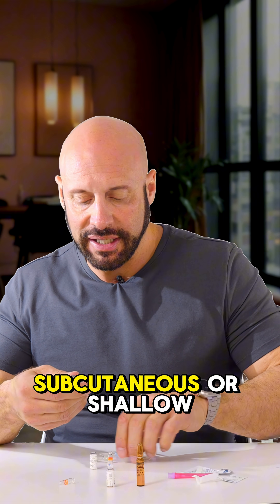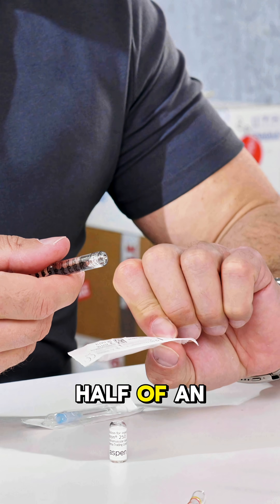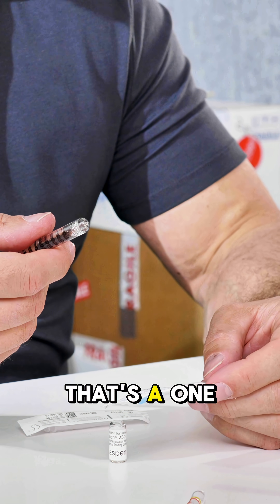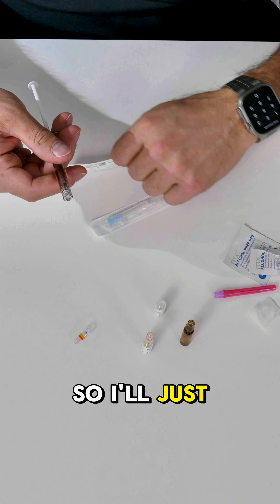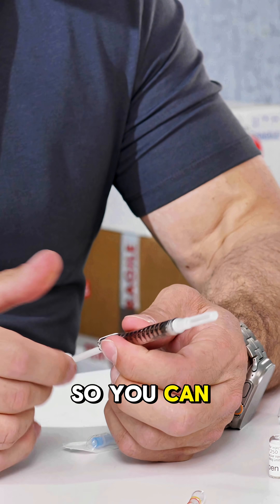Then you can pick which needle to use. If you want to do a subcutaneous or shallow intramuscular injection, you can use the 27 gauge half-inch needle. Or if you want a more deep intramuscular injection, there's a one-inch needle you could use as well. I'll just pick the 27 gauge so you can see it.